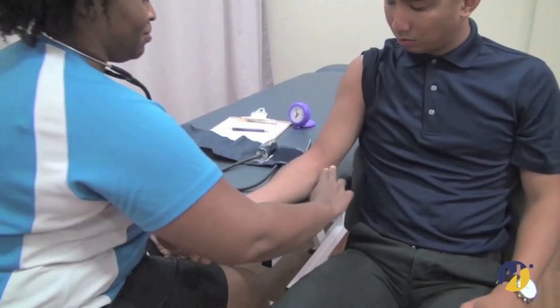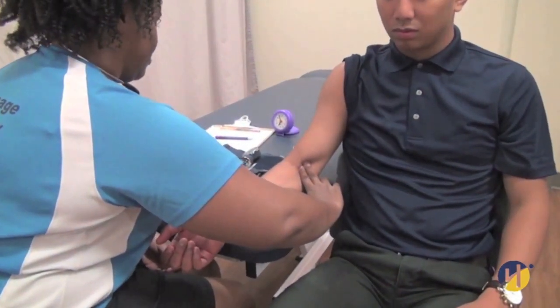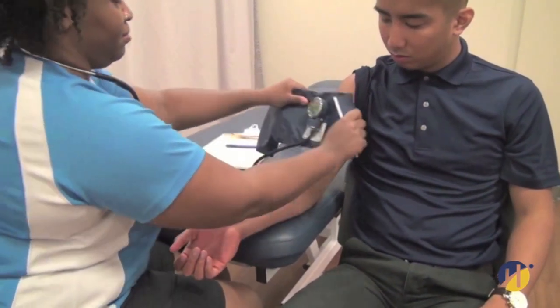Once you and your client are prepared, you may begin with the measurement itself. Palpate the brachial artery. Place the cuff with the edge 3 cm above the elbow crease and the bladder over the brachial artery.